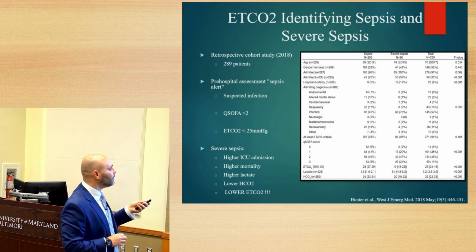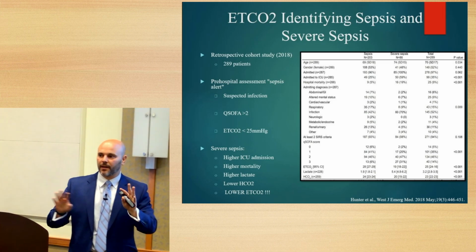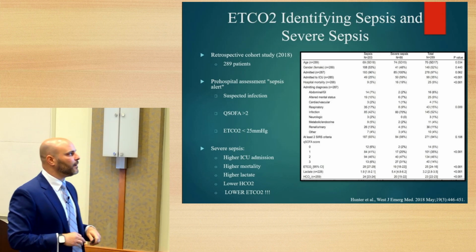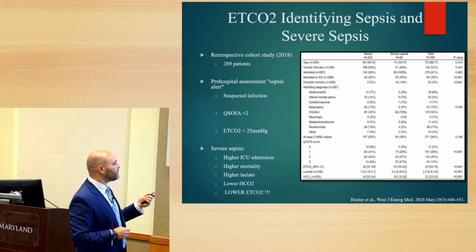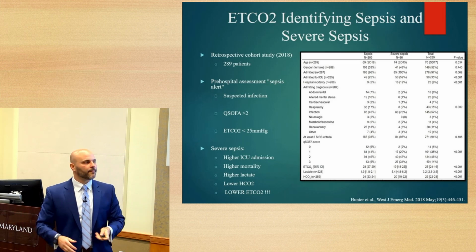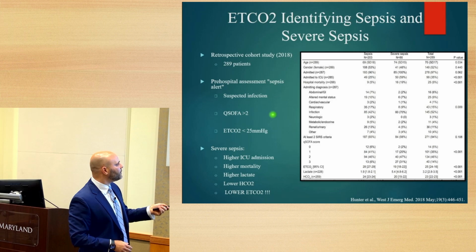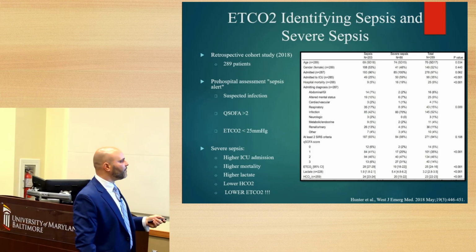And this is another study by Hunter in the pre-hospital setting, on sepsis and capnography. If anybody wants to read about it, Hunter's the guy. He has about a study every two years, indicating different uses and predictors with end tidal. This is a 2018 study of about 300 patients. He now compared end tidal to qSOFA. So people with qSOFA criteria of 2 or greater and suspected infection, and then did the same thing: end tidal less than 25, end tidal greater than 25.